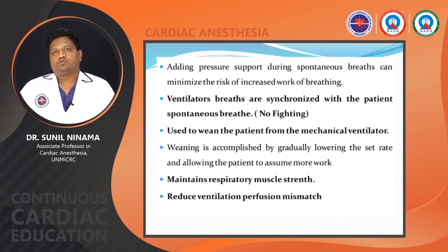Adding pressure support to the spontaneous breath can minimize the risk of increased work of breathing. So you have to set the pressure support also. Ventilator breaths are synchronized with the patient's spontaneous breath, so there is no fighting. It is used to wean the patient from the mechanical ventilator. Weaning is accomplished by gradually lowering the set rate and allowing the patient to assume more work. It maintains respiratory muscle strength and reduces ventilation perfusion mismatch.